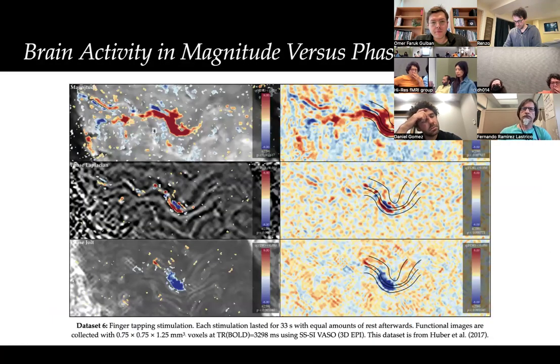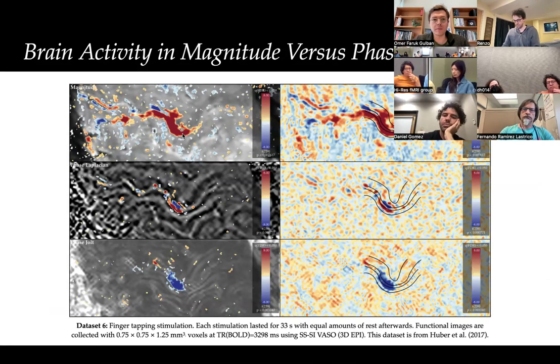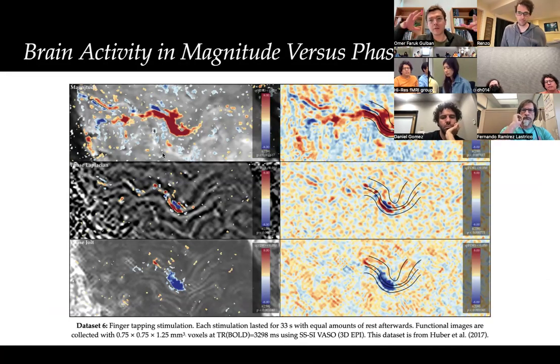Yeah, I believe definitely there is a spatial relation. For instance, if you agree that at these long echo times you detect oxygenation changes in the phase and phase spatial derivatives, it basically implies that it has to be at least a subset of the magnitude activity changes, because they are tightly coupled. That's what Ogawa argues. That's what BOLD fMRI is built upon. But this phase thing comes up quite clearly when you have a large intravascular component in your signal.